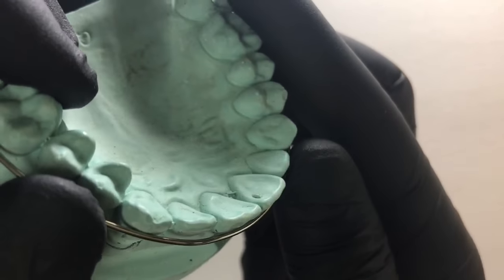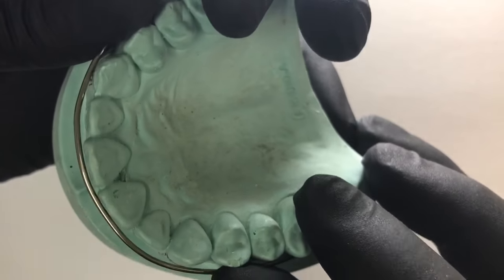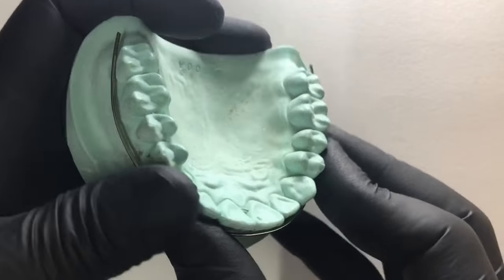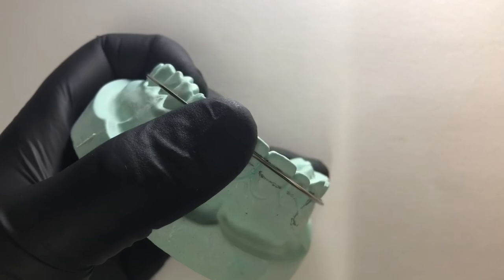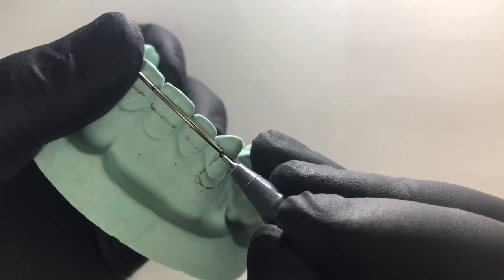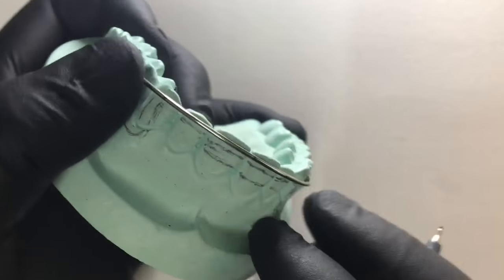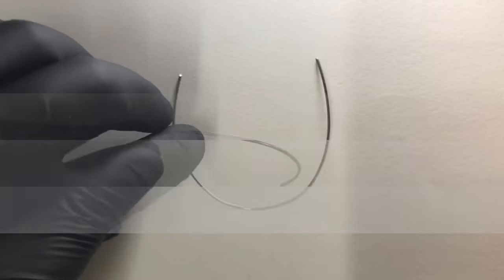Now you can see that the central incisor and the canine are being touched by the wire component. First we need to do some reference point markings so that we don't make any errors. We mark the central point, then we mark two points at the medial part where our U-loops would begin, to again avoid any errors.